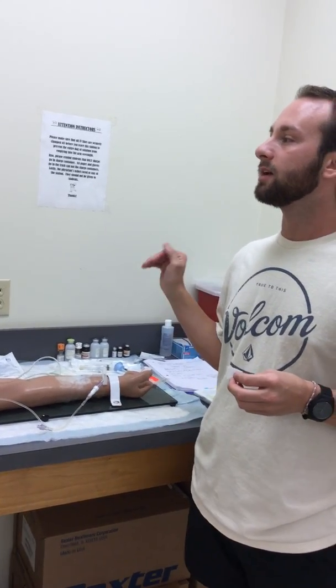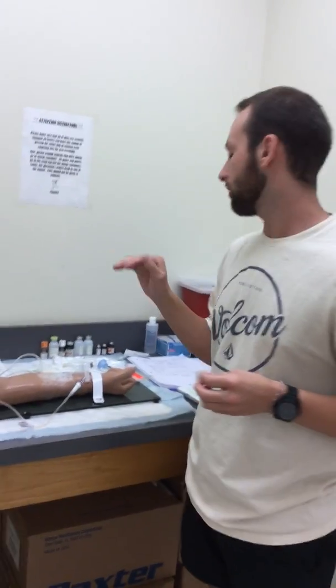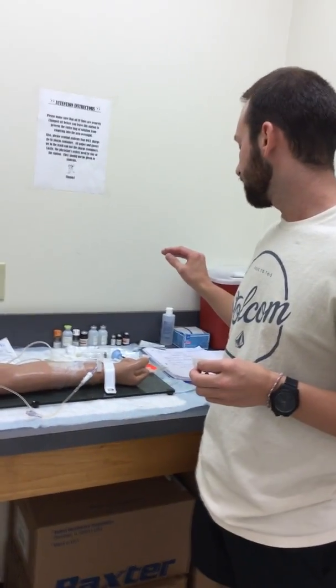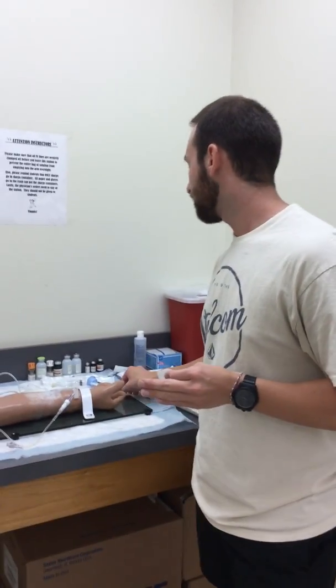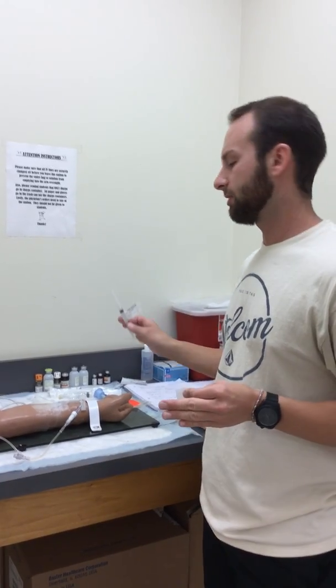And for compatibility, we want to make sure that it's correct for both of the medications before we even go to our room. And then we're going to want to make sure that we always explain the procedure to the patient and make sure that they know what's going on. And you also got to make sure that it is compatible with these to make sure you don't have to stop it or anything like that.